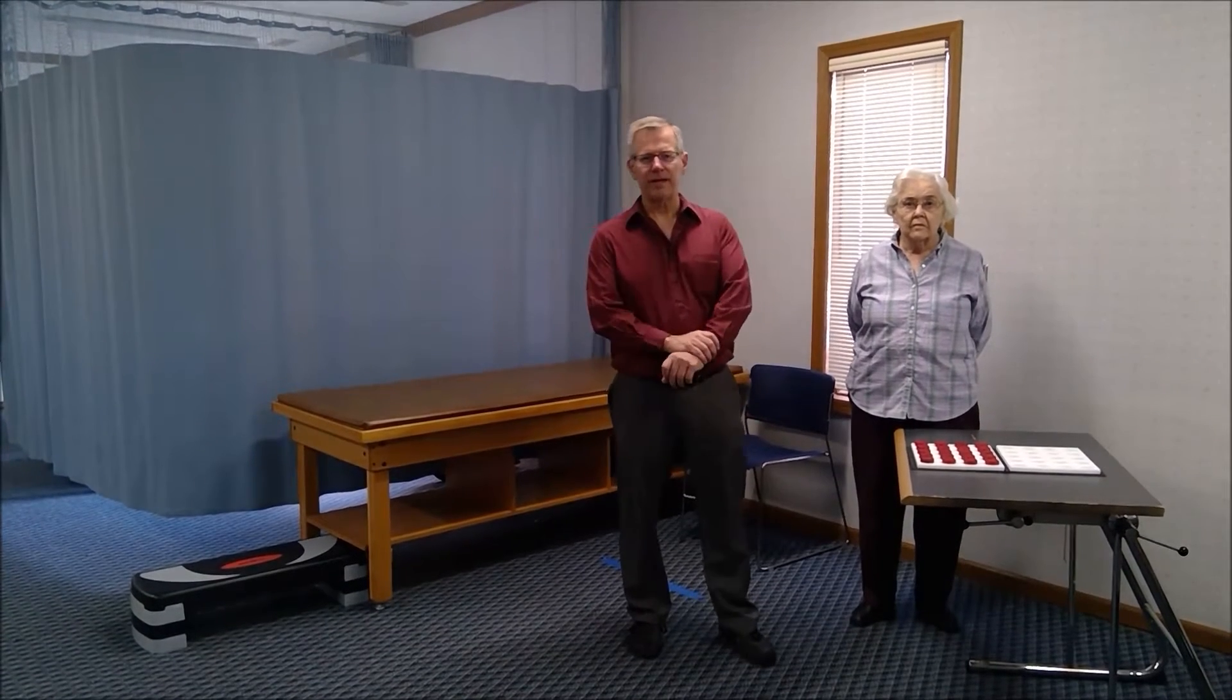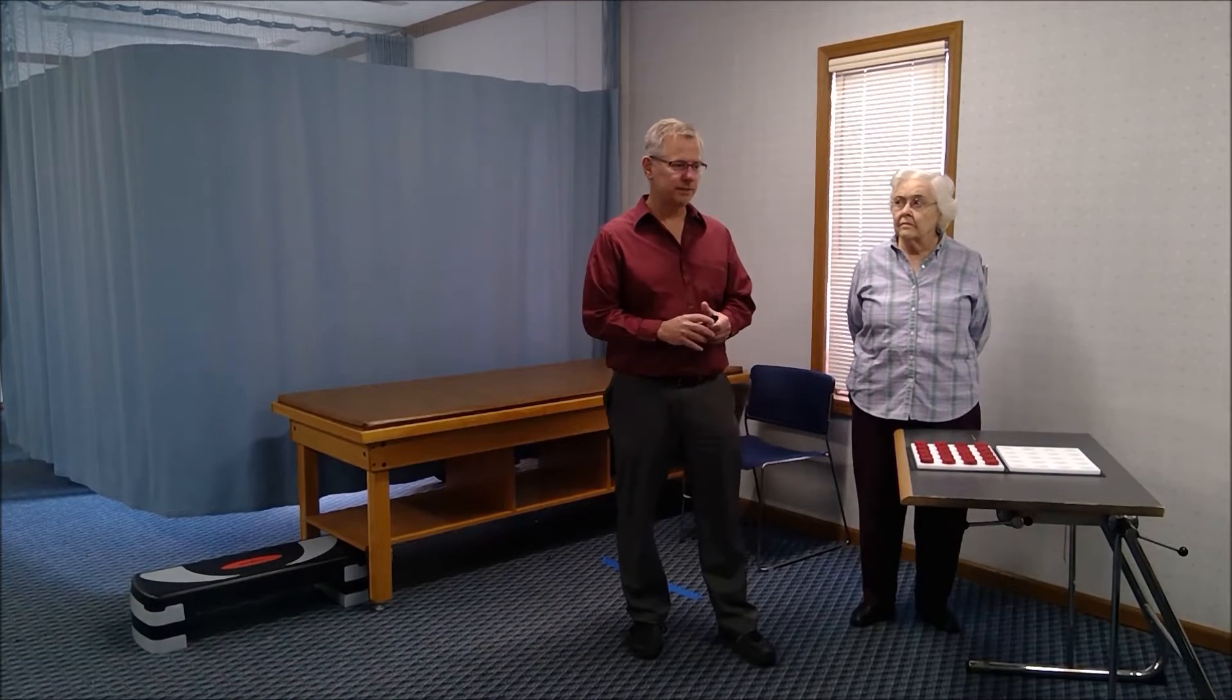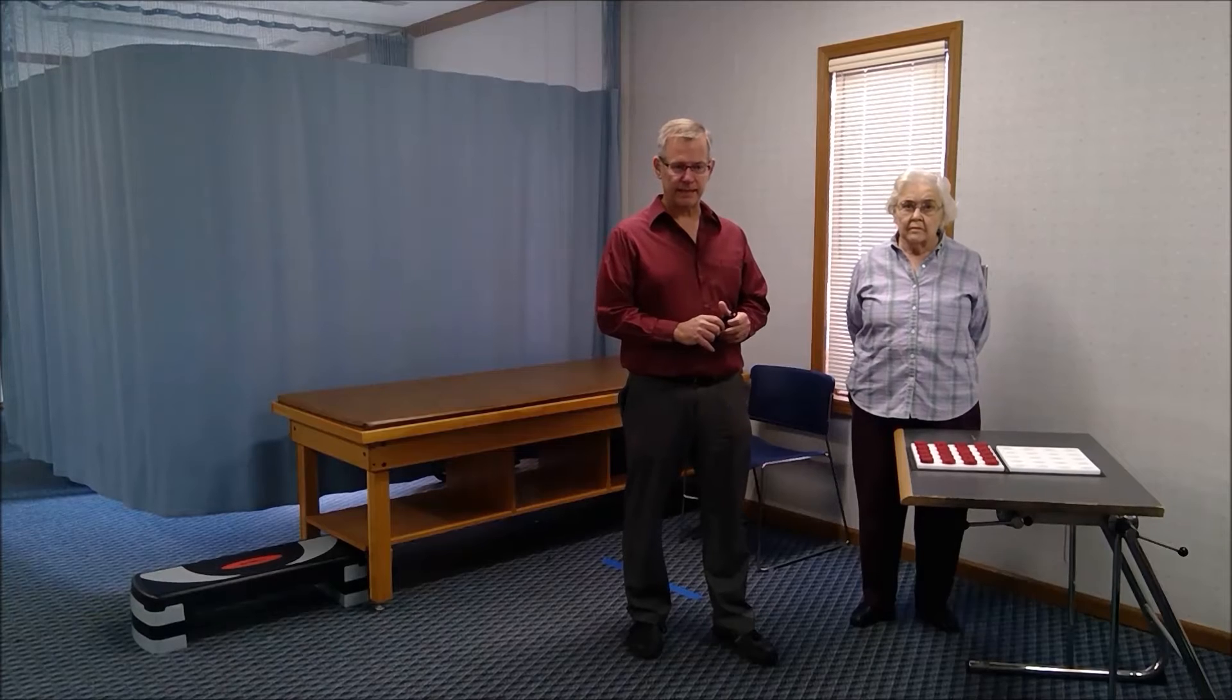Hi, my name is Dr. Rick Wickstrom. I'm a doctor of physical therapy and an ergonomic consultant, and I'm here today to demonstrate the workability rate of manipulation test.